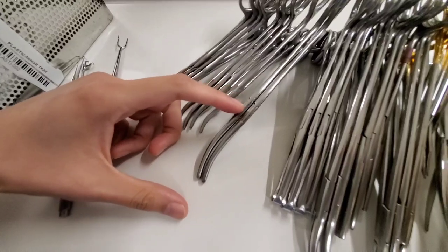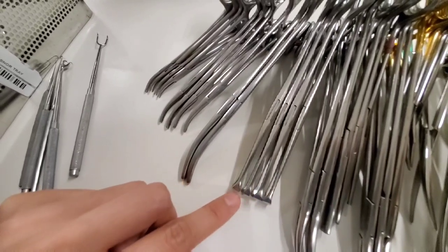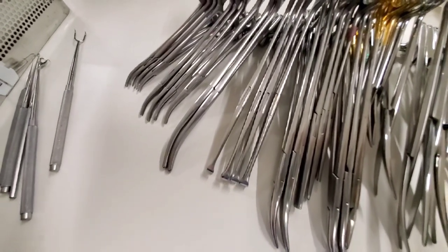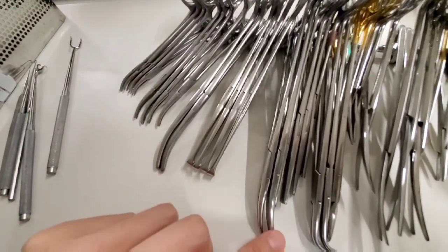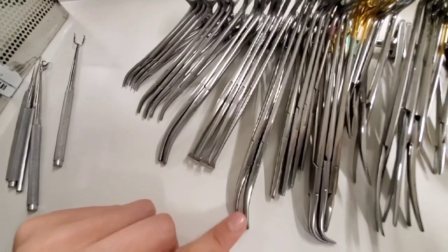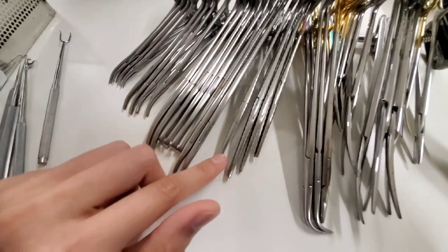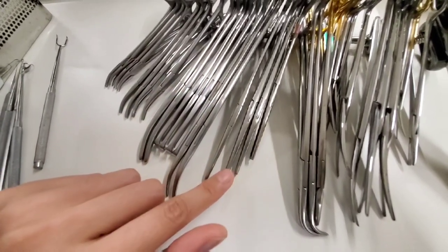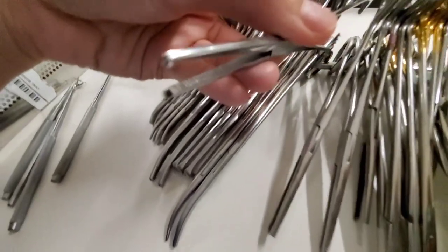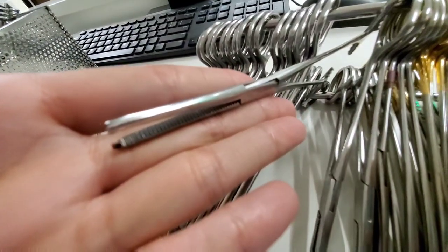Kellys are for when you ligate; sometimes they're used for abdominal procedures, but the ones we use are longer because you're deeper in the belly. Allis clamps are good for retracting and holding tissues — we use them a lot in colorectal procedures. Tonsils are used in general surgery or colorectal. Kochers are very useful in all abdominal surgeries and orthopedic as well, for holding fascia because they have teeth that grip.